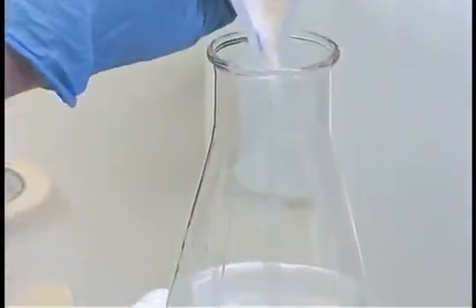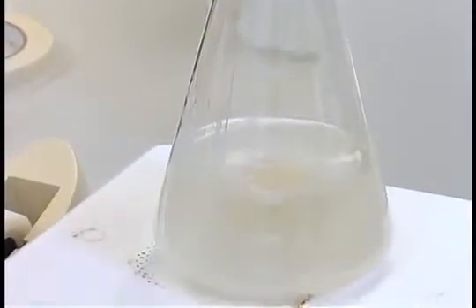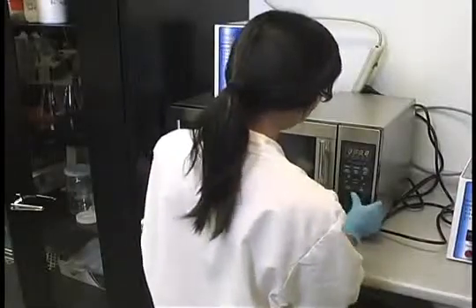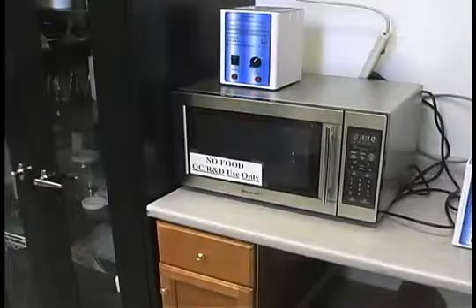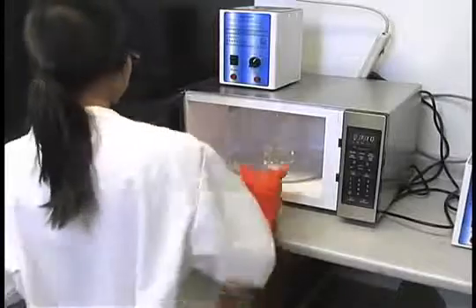If a gelling agent such as agar or gellan gum is used, you should add the components at this time. These compounds will not completely dissolve until heated. An alternative technique is to dissolve and heat the gelling agent in the remaining 20% of tissue culture grade water that has yet to be added to your batch production container. This solution can be heated until the gelling agent is completely dissolved on a hot plate, microwave, or in the autoclave.